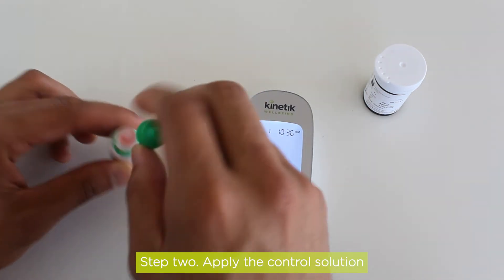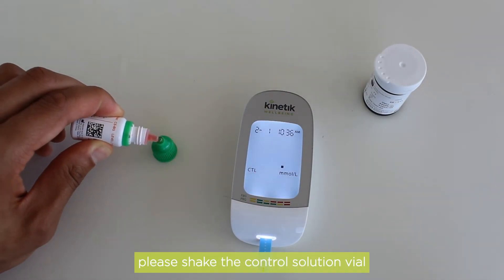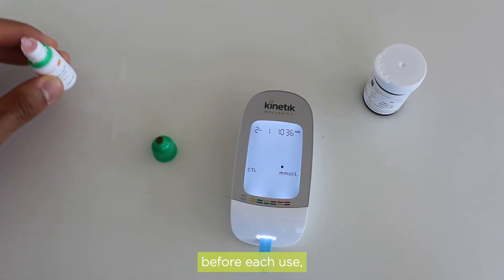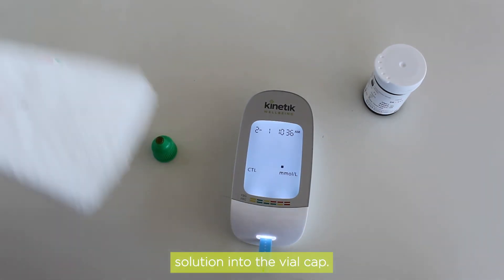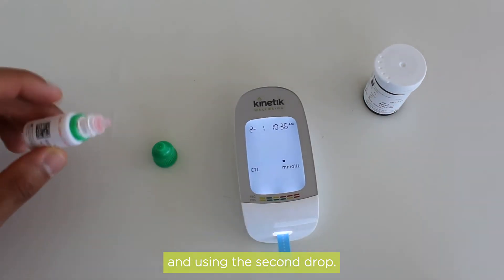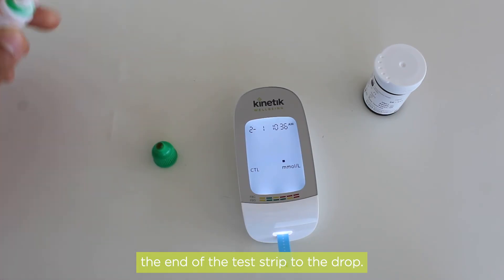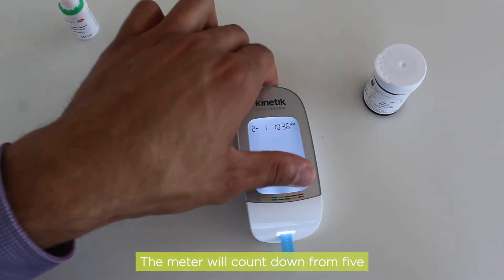Step 2: Apply the control solution. To do so, please shake the control solution vial before each use. Squeeze a drop of control solution into the vial cap. We recommend wiping the first drop and using the second drop. Hold the meter and move the end of the test strip to the drop.